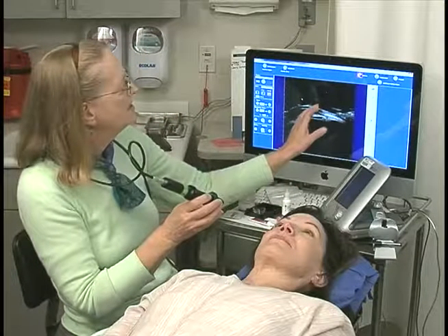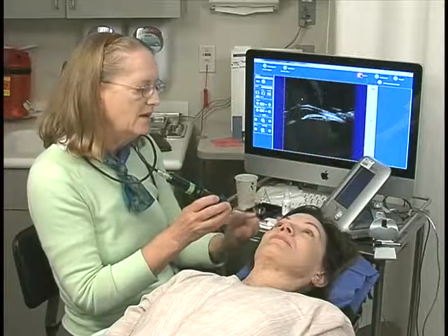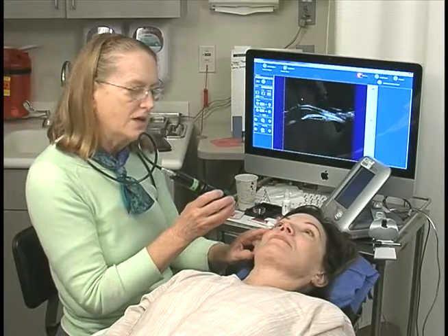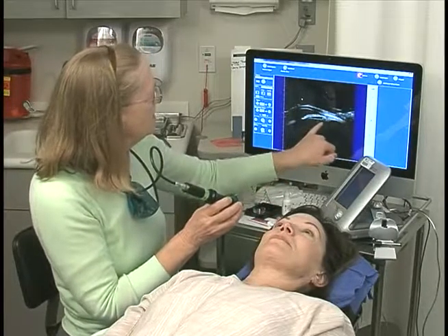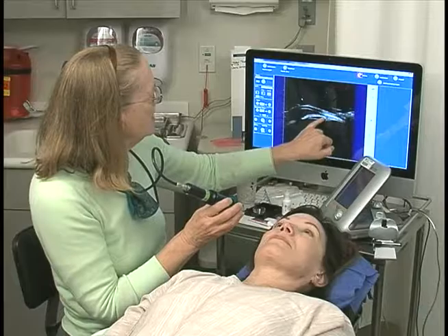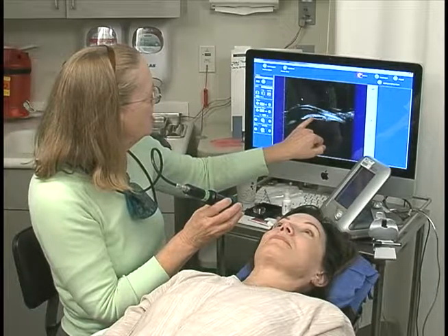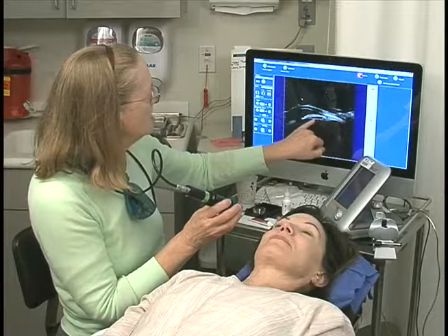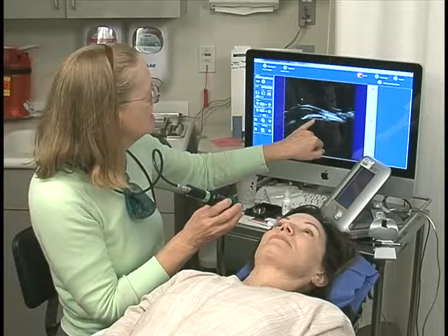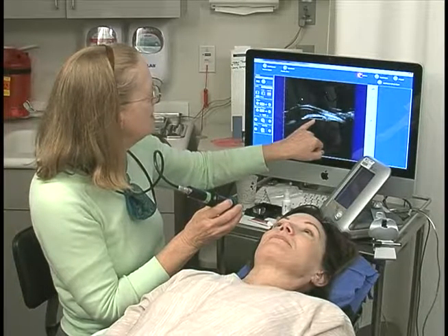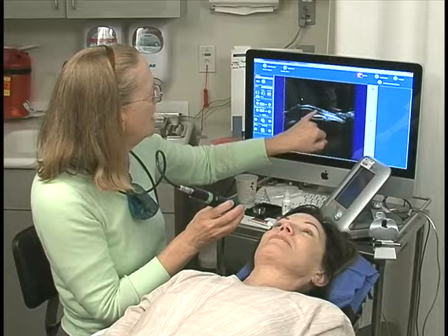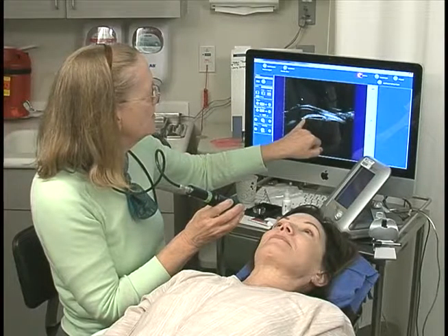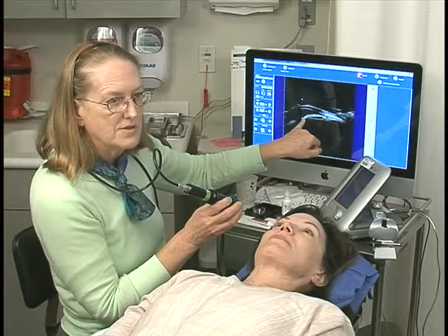Now I have a really nice angled scan. That happens to be her three o'clock angle, where you see the ciliary body, the pigment epithelium of the iris, the zonules attaching to the anterior lens capsule, and a beautiful open angle and the curvature of her iris.